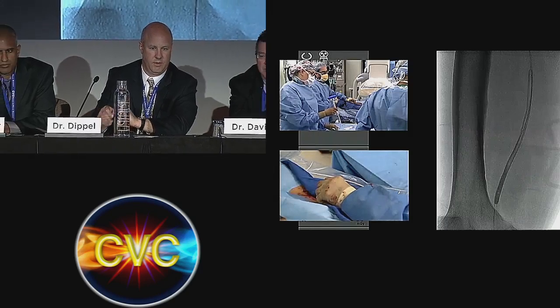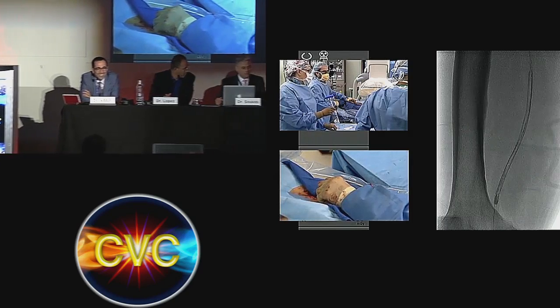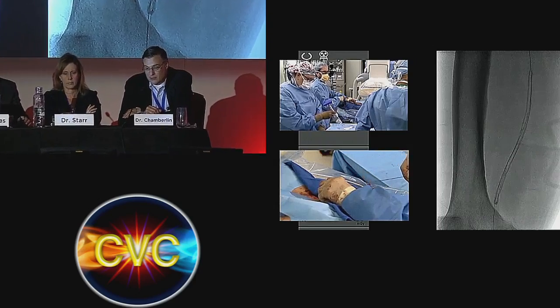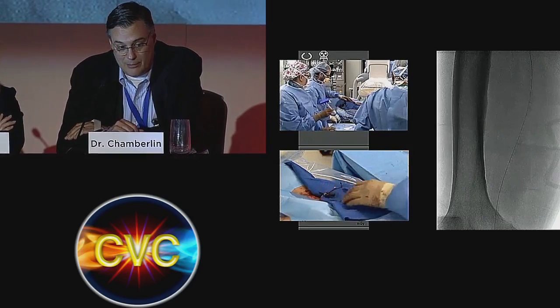Jack, what would you do? I know what you do, but you know. I don't want to be too predictable, but those look soft. I don't think they're calcified. They're short. I think you could do a safe directional atherectomy and never balloon it, and you never stent it. I think they would do very well.